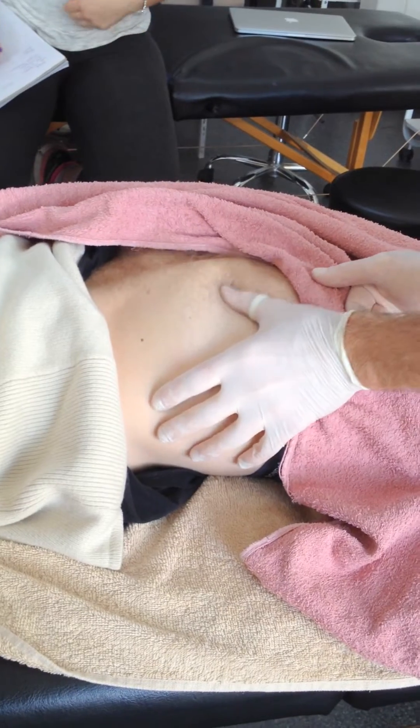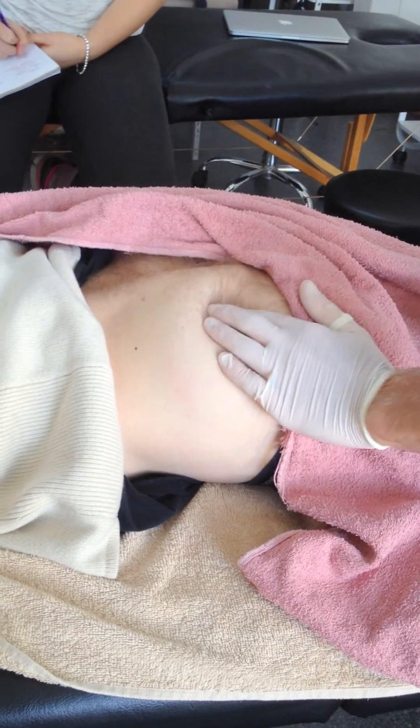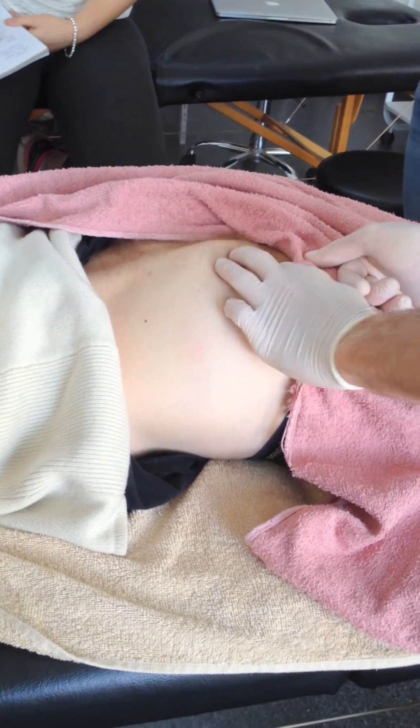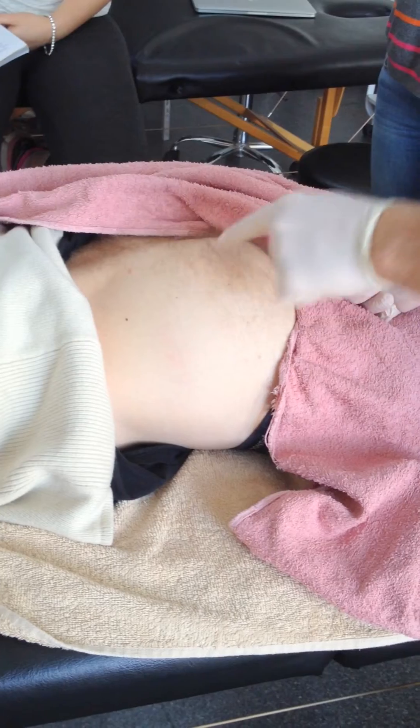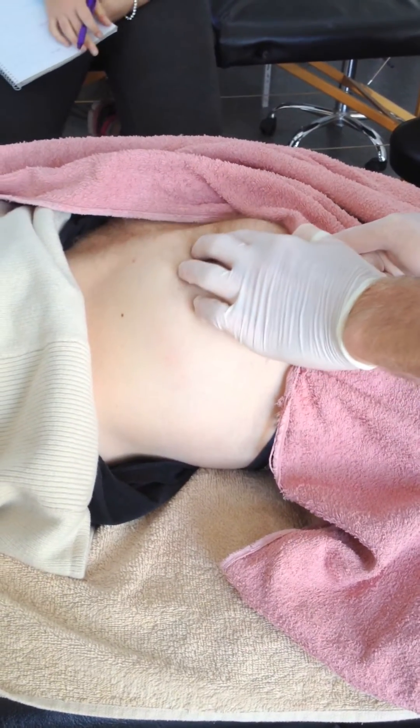I tend to find with this flat palpation just cross-fibre the easiest to feel the trigger points. There's obviously the trigger point up higher and then there's the lower ones down through here as well, so you can palpate through that region.